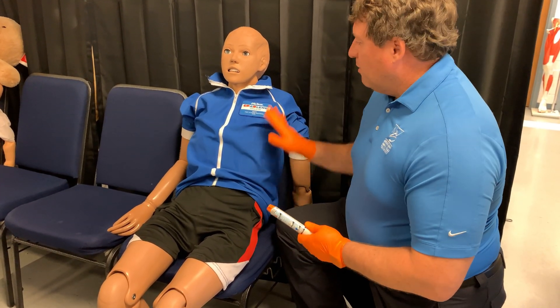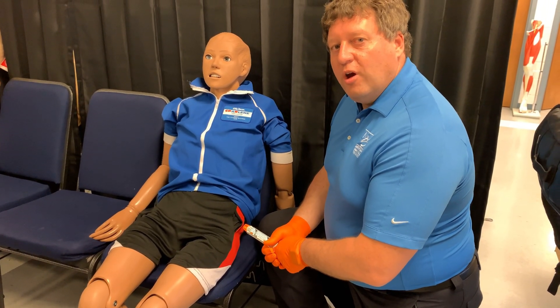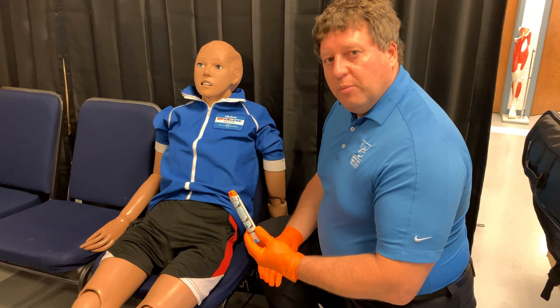Epinephrine auto-injector. My patient has eaten some peanut butter cookies he wasn't supposed to and is now having an allergic reaction. I can hear some stridorous respirations and his face is starting to swell a little bit. I think he's going into shock, so I'm going to assist him with his epinephrine pen.